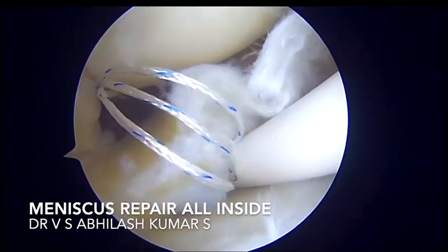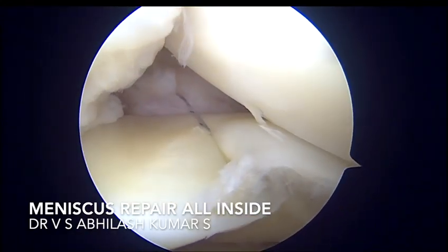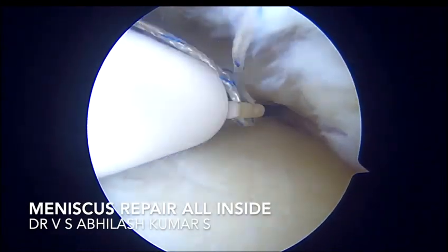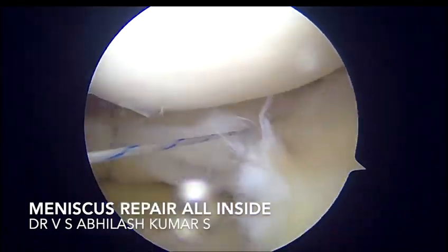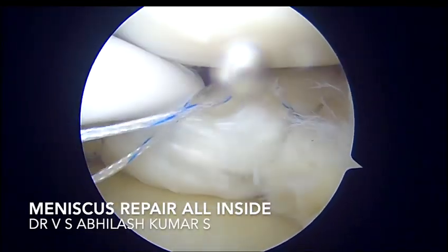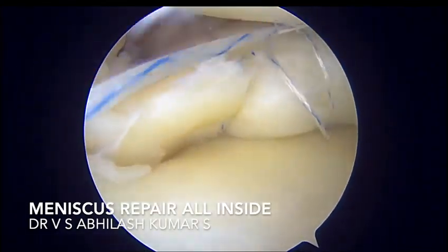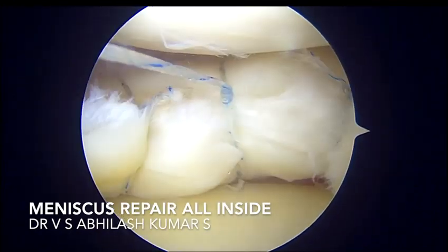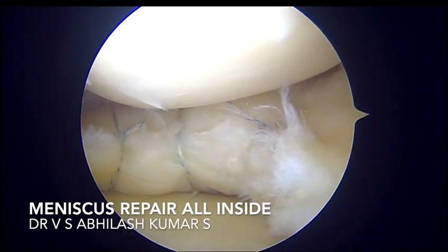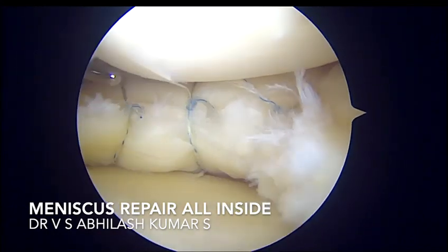The tear which was created is being closed using a FasT-Fix. There's a second FasT-Fix which is used to repair the meniscus tear, which is laminar in nature. This is the third FasT-Fix. And that's the final repair. The rent is being completely closed using a FasT-Fix, and the meniscus laminar tear is being repaired.